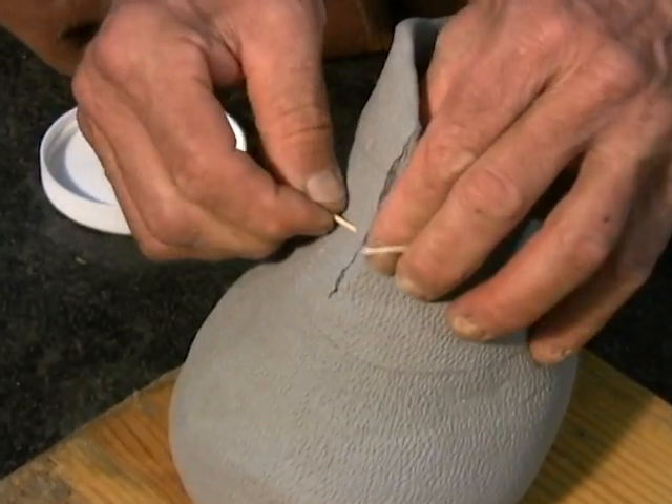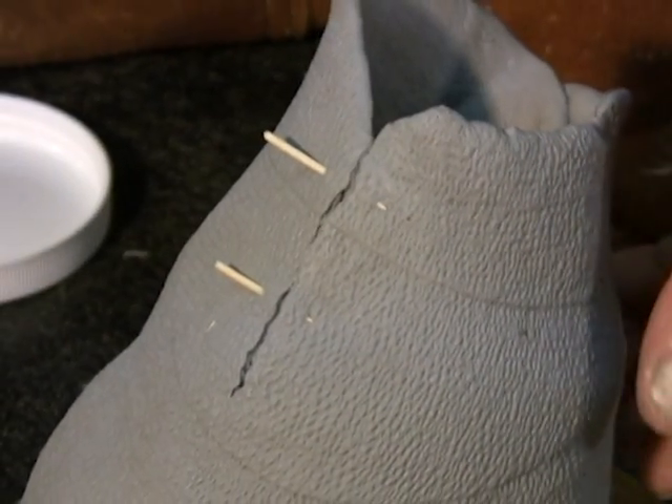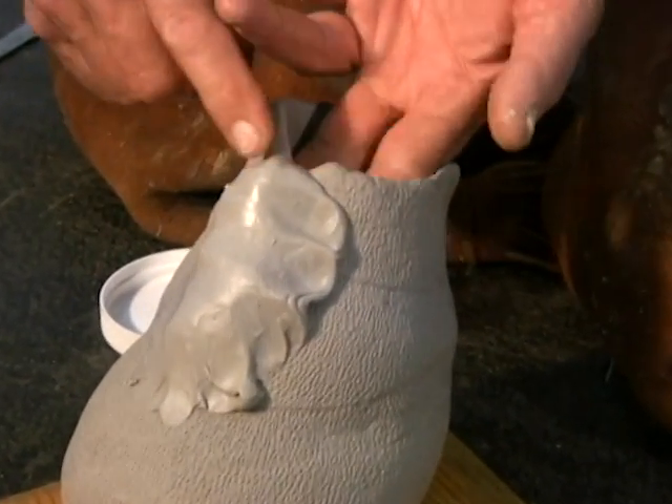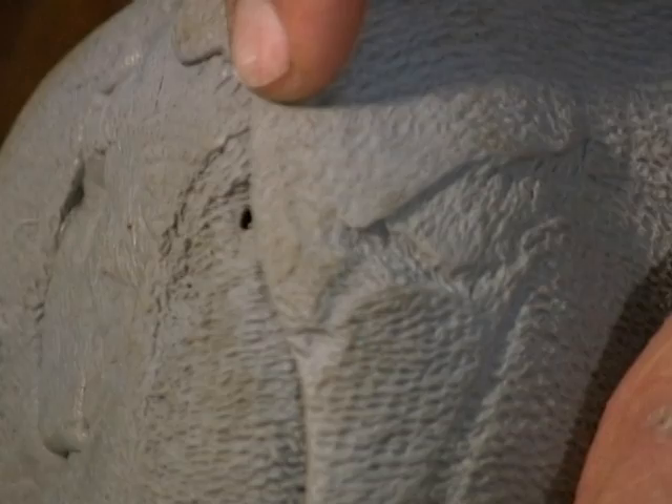Now that we have the mold off, we can repair the cut. Simply stitch the cut using toothpicks and use some of the remaining ACS to patch the cut, using your index finger to smooth out the edges and blend the patch into the mold. If you find a hole in the mold, as seen here, you can patch it by using the remainder of the ACS and again smoothing out the edges into the mold.